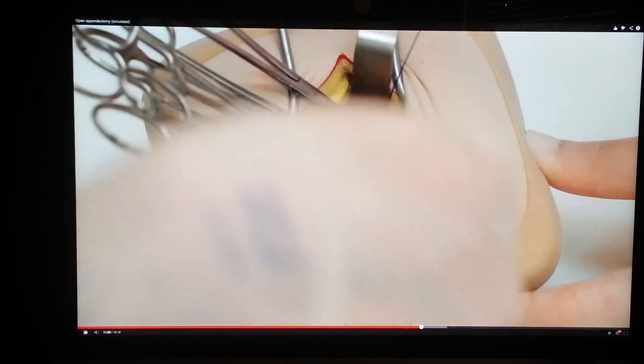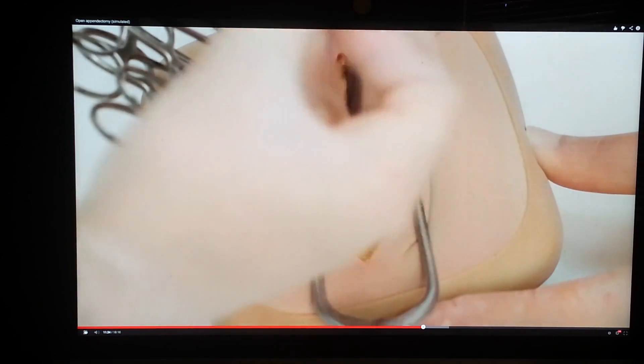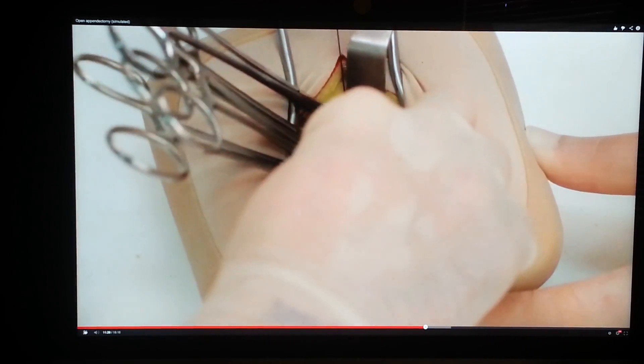The peritoneum is closed using a continuous suture of 2-0 PDS. It may help to place clips on the free edges of the peritoneum.